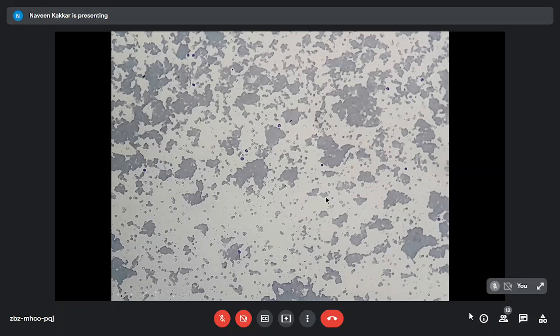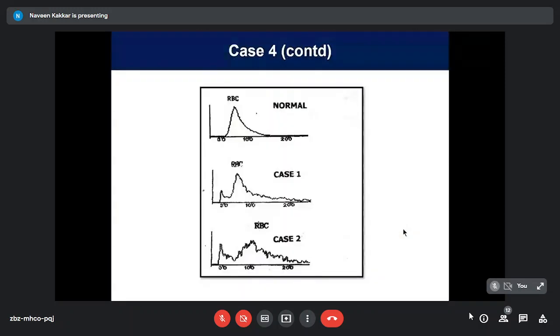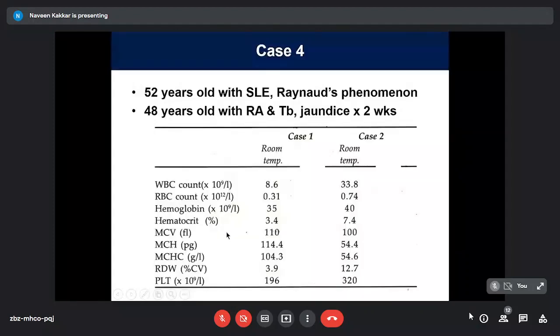Imagine 6 RBCs being counted as 1. So you're undercounting your red cells. If you're undercounting your red cells, your other values except for the hemoglobin will be wrong, and all the indices calculated will be wrong. That's the histogram in these two cases. That's normal. That's case 1 and 2. A very irregular flutter, almost sawtooth-like, going beyond 200 femtoliters. So here actually the histogram is telling you the diagnosis and also the indices. Before you even see the smear, you know what to expect.